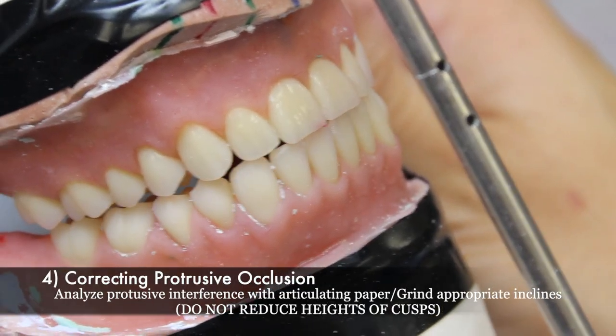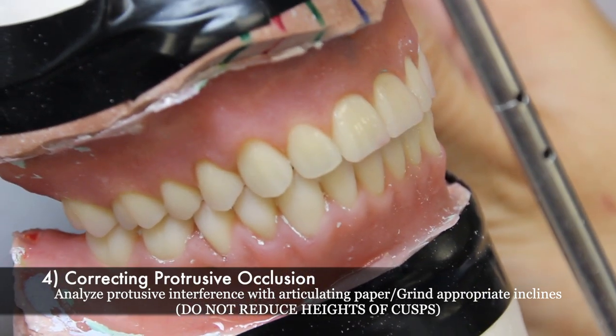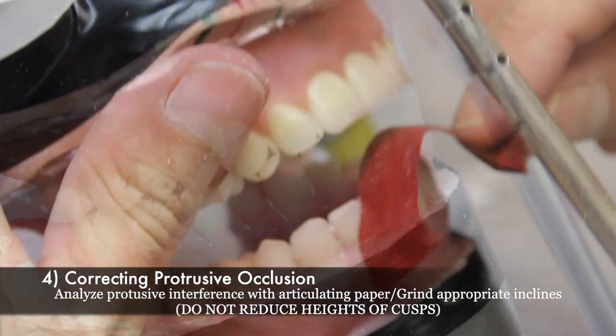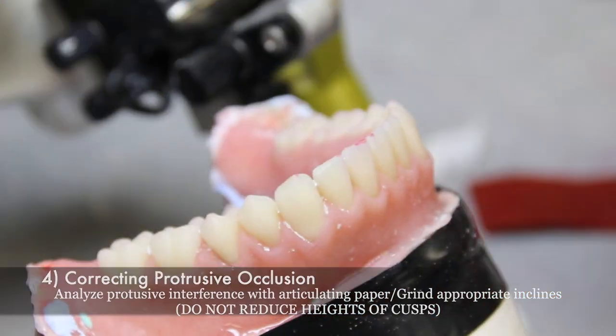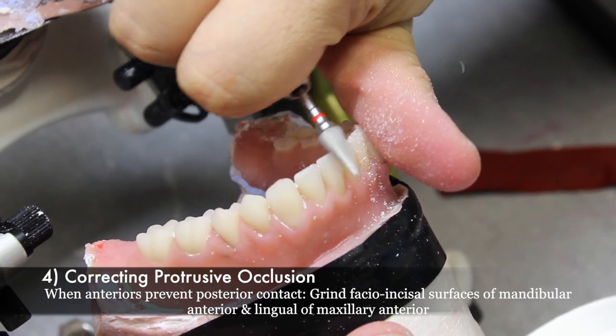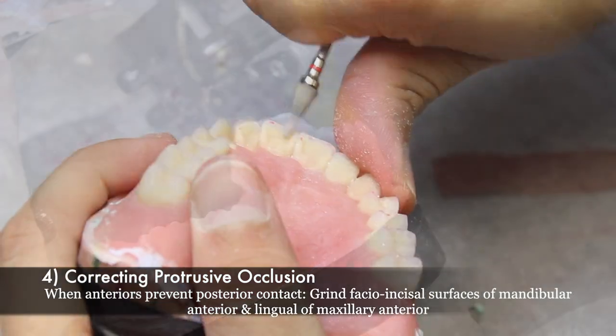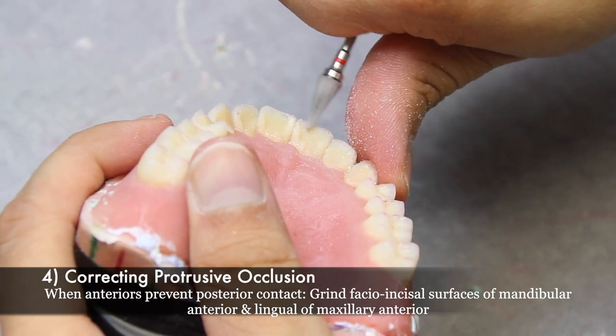The next step in selective grinding is correcting protrusive occlusion. To do this, you must analyze protrusive interferences with articulating paper and grind appropriate inclines while avoiding reducing the height of cusps. When anteriors prevent the posteriors from contacting, you will grind the facial incisal surfaces of the mandibular anteriors and the lingual of the maxillary anteriors.